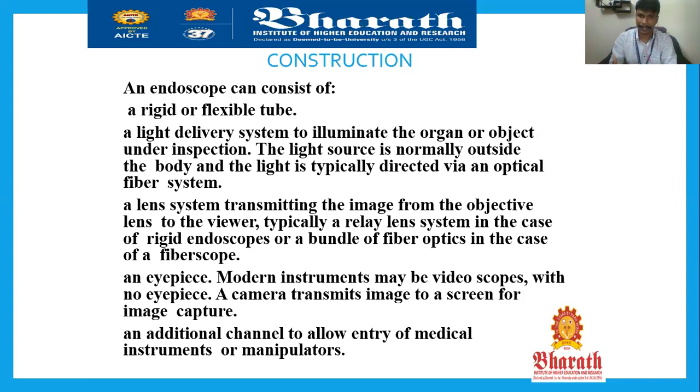It comes under medical instrumentation, because the result is not captured or recorded non-invasively. It is sent inside the human body, so it comes under invasive methodology. So it does not go under digital medical imaging techniques. It comes under the application of medical instrumentation.